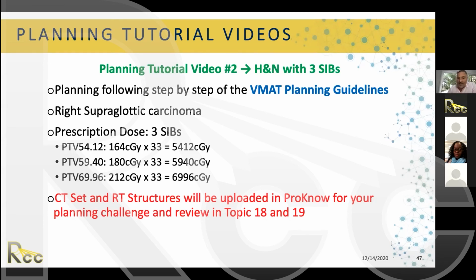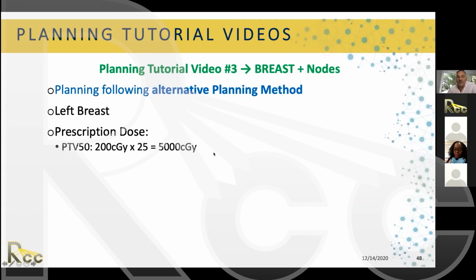But as an extra, we also prepared 3 more tutorial videos for you to watch. This is an alternative planning method. These are methods that we use at Memorial Sloan Kettering, and I asked very helpful and amazing planners that we have in our institution to help with the planning tutorial. They're also going to be available for you to watch, so you have a different perspective. They're different institutions, they do things different ways. But at the very end, the final product, the plan, needs to be good. It needs to be perfect, whatever method you use.